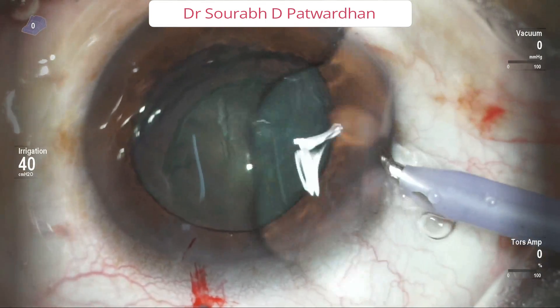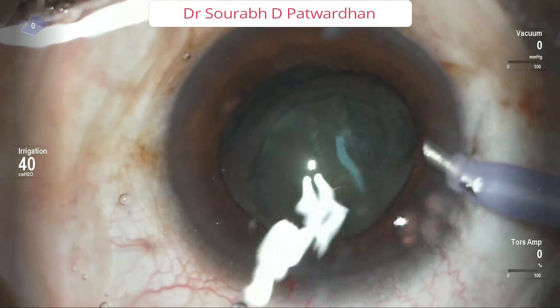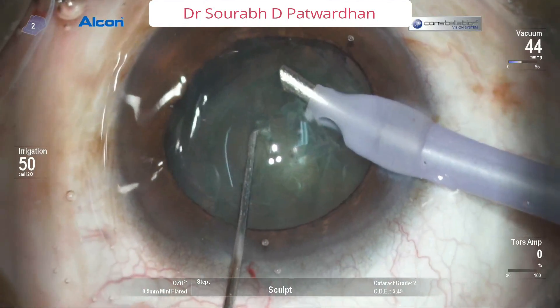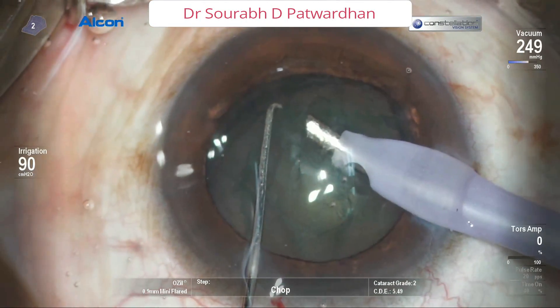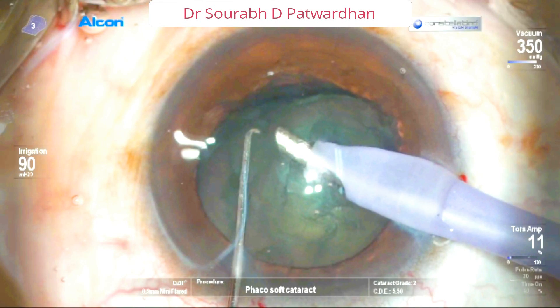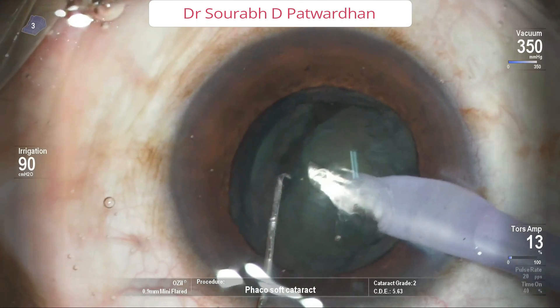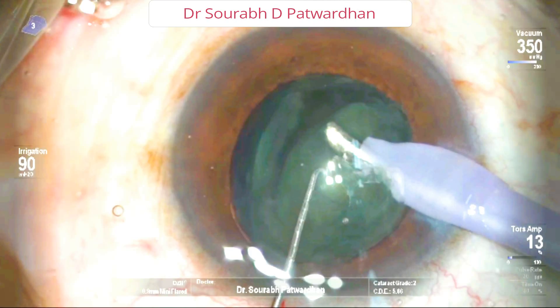So now how to emulsify this prolapsed nucleus. First go in with lower IOP. Position your phaco probe with bevel down, and the tip should be at the edge of the nucleus. Just watch where the tip is lying. It should not be very close to the CCC margin — at least one millimeter away — but at the edge of the nucleus. Don't try to go too much into the center; stay at the edge.